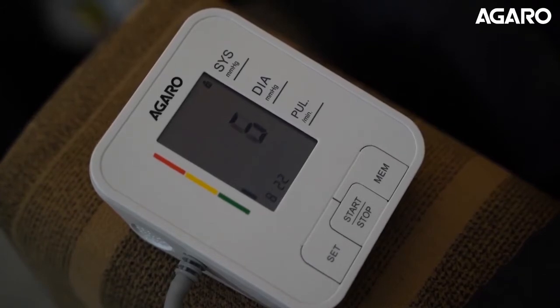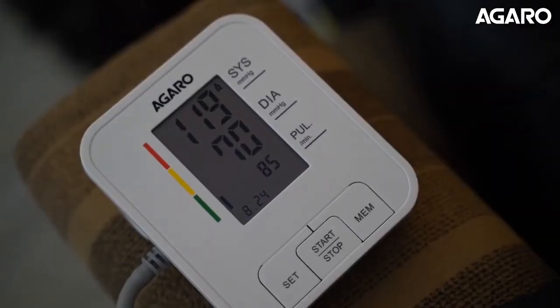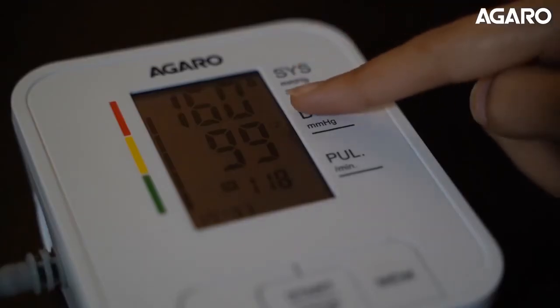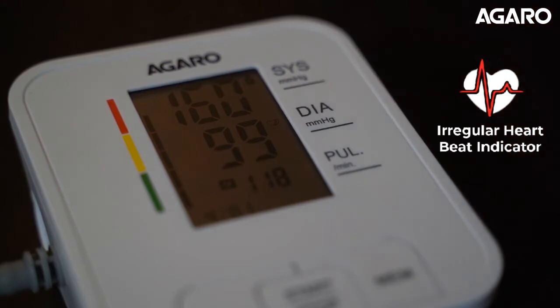The device is compliant with WHO as well as European blood pressure guidelines and is IEC certified. The Agaro BP601 uses oscillometric technology to give you the most reliable blood pressure measurements. It is equipped with an irregular heartbeat feature that helps alert you of any unusual heart movements that would require a medical check-up.